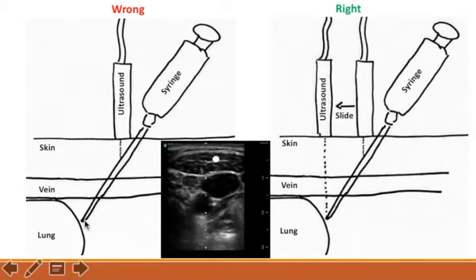That's why you should always aspirate as advancing, because in this case you should have aspirated blood as you first got in, and that would be your clue that you entered the vein. This person wasn't aspirating, continued through the vein, and now is approaching the lung apex. During advancement of the needle, you should be sliding your ultrasound constantly to actually track the true needle tip. And what that will look like is you find your needle tip way down here, much deeper than appreciated.